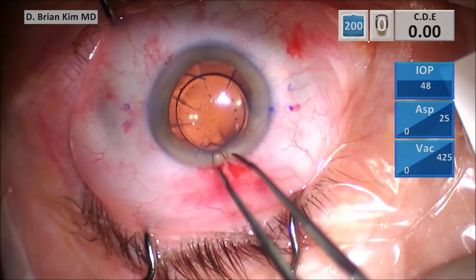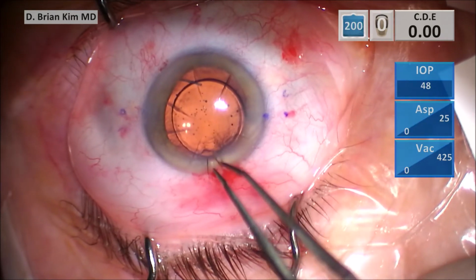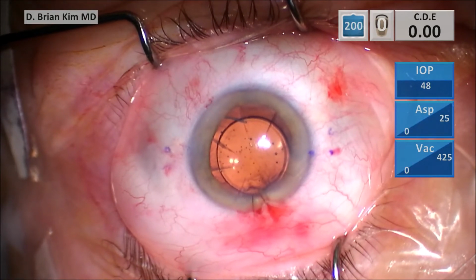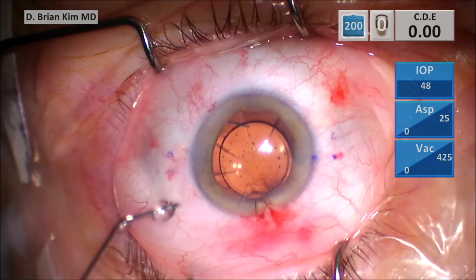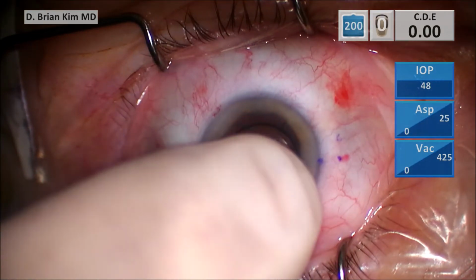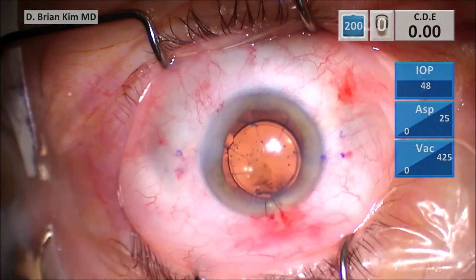So I placed that trocar, was able to use a vitrector, lift the optic up, grab it with microforceps, and using a handshake technique, I was able to get better support, grabbing it, popping the lens up, cutting it out, cutting one side at a time, making sure I'm holding the lens pieces and securing them so they don't fall back, making sure I burp that bag material using the infusion through the AC maintainer to burp it out.